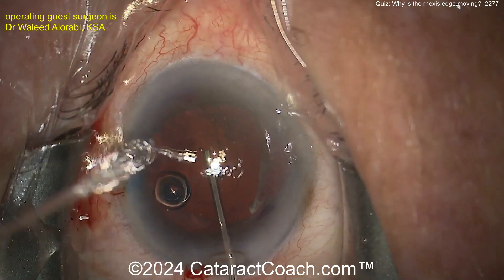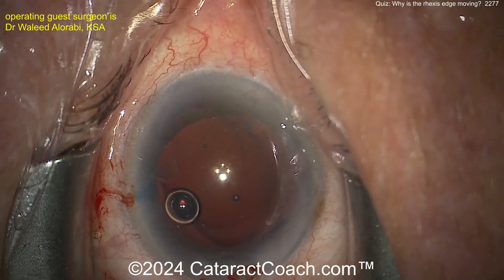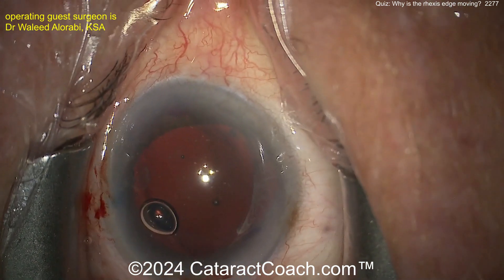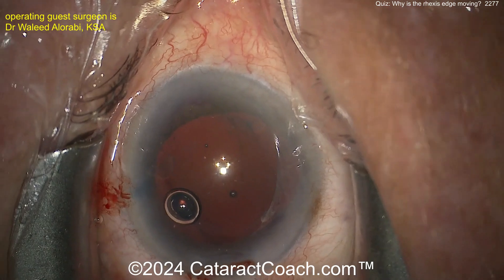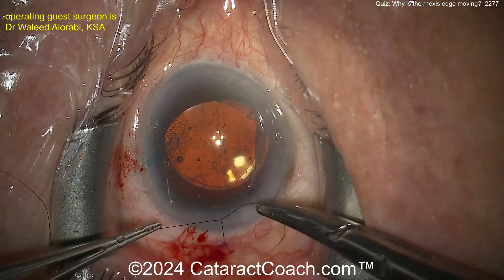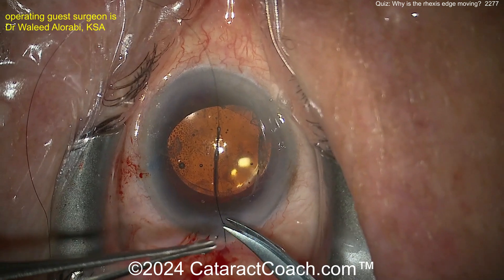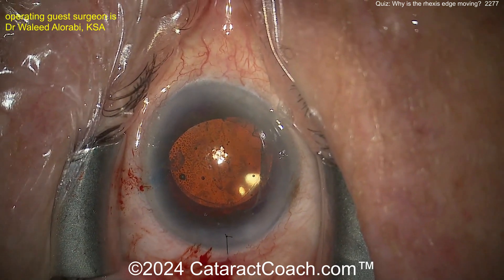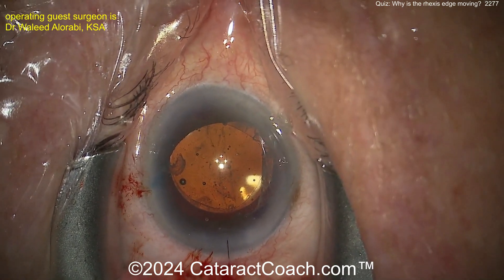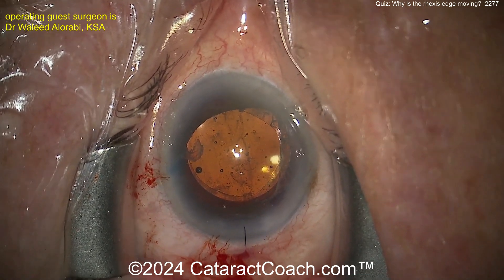A little more viscoelastic is always a good call. Now enlarging the incision — okay, that's reasonable. Looks like we're going to put a three-piece lens. The video has been cut — the lens is already in the bag. Rotating it, suturing in, getting the knot buried. Now let's use bimanual I/A to take out the viscoelastic.